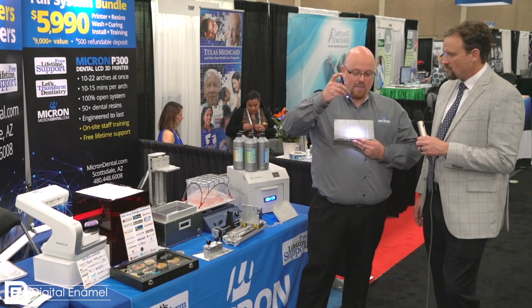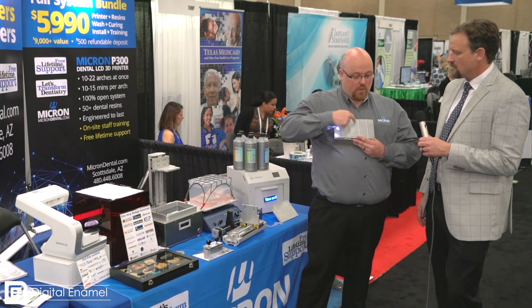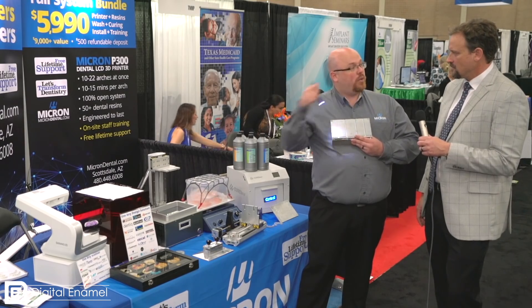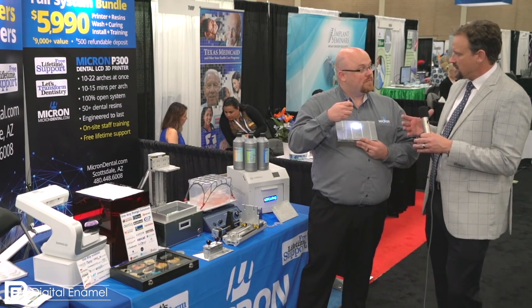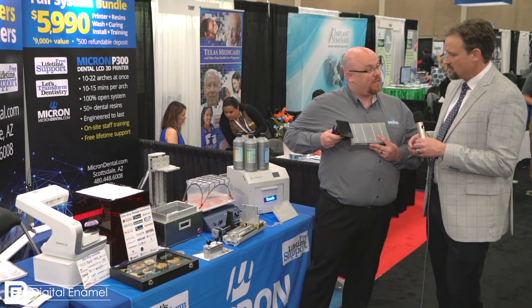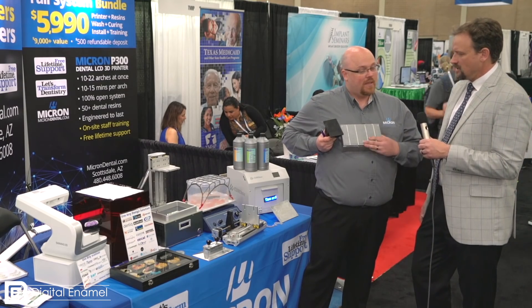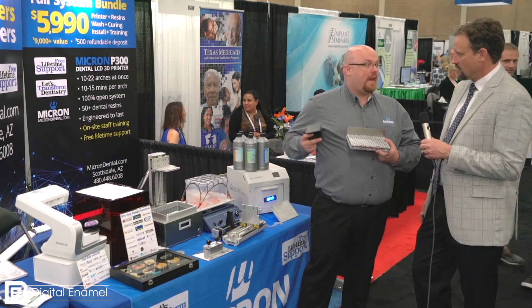With a DLP light source you have a bright spot in the middle and then dimming on the outside — accurate within about one arch but inaccurate for two arches or across a larger build plate. So would they be limited on the size of their build plate? They are. DLP systems usually run about this big — this is your standard 47 micron DLP system. By taking the light source and making it diffuse, we can scale that up dramatically.